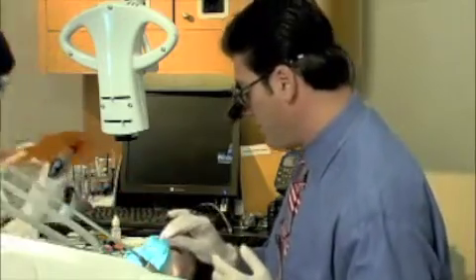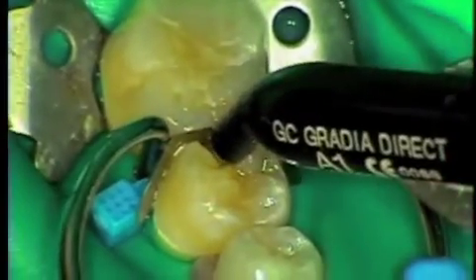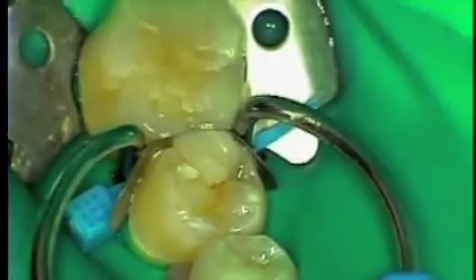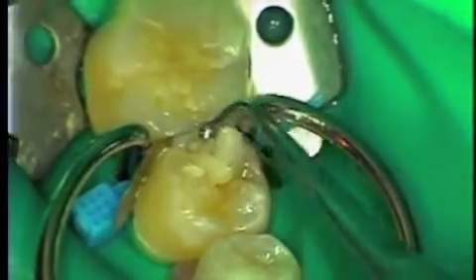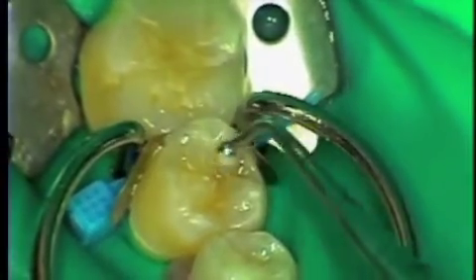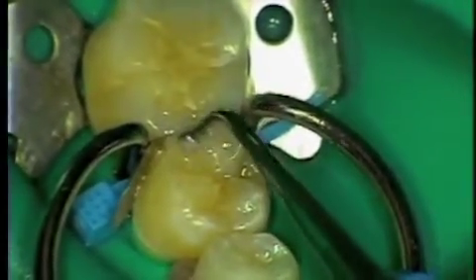Now we're into our last increment of composite that we're going to use. I'm going to use A1 Gradia Direct composite. Place the composite and, using a little bit of no-stick material on my glove, I'll use a ball burnisher to condense the composite into the space. Now the key to this is working quickly and condensing, not just placing. If you don't condense, you can pick up air voids within the composite.